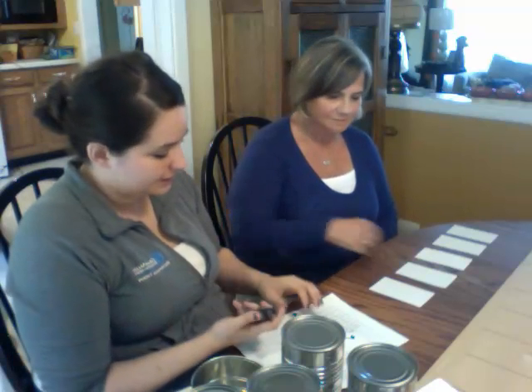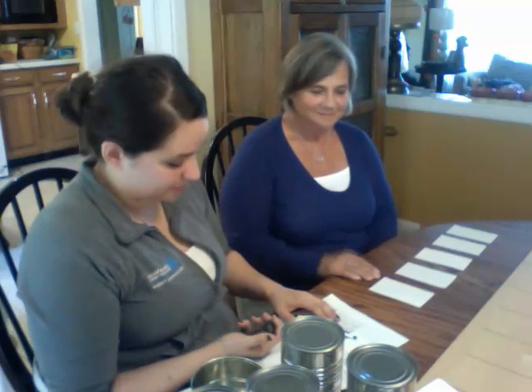Yes. All right, ready? This is your non-dominant hand. Go ahead and set it on the table. You're not in trouble. You can't get in trouble here. This is safe for you. All right. Ready? Go.